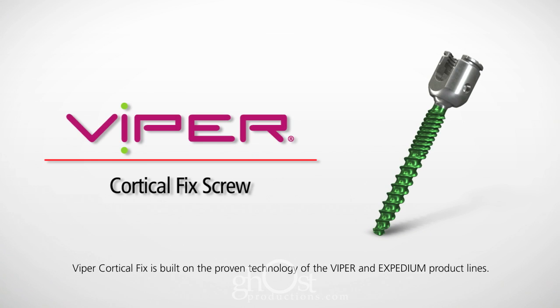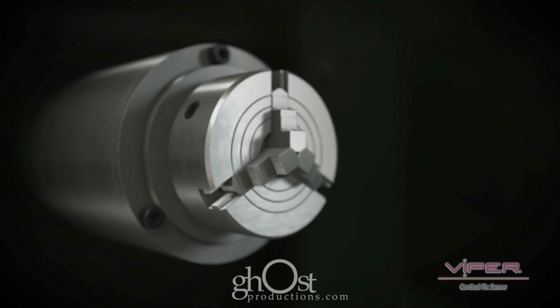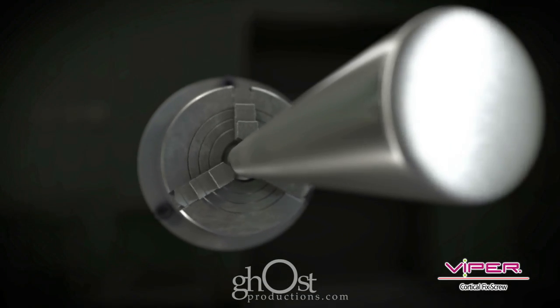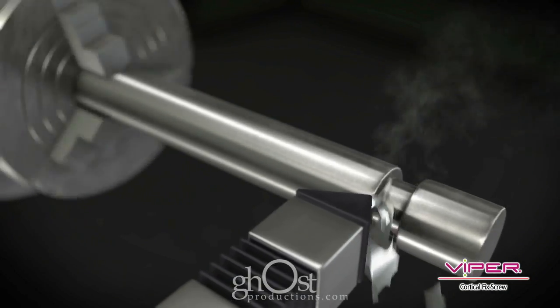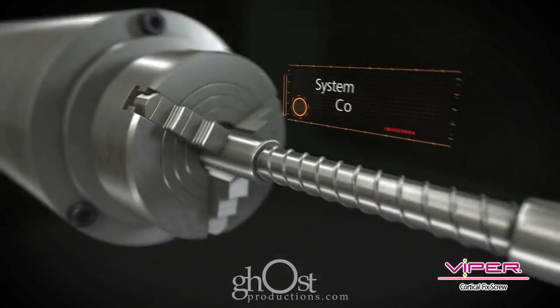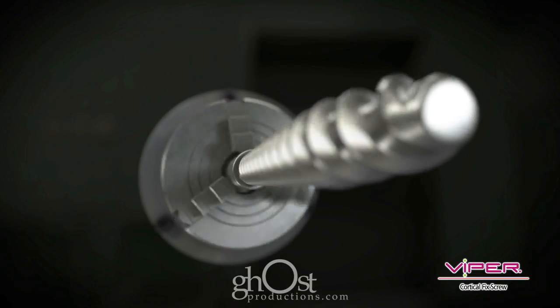Viper Cortical Fix is built on the proven technology of the Viper and Expedium product lines. The dual lead thread extends the length of the screw shaft and dictates the rate of insertion. This constant thread form allows for compatibility with standard Expedium and Viper dual lead taps.